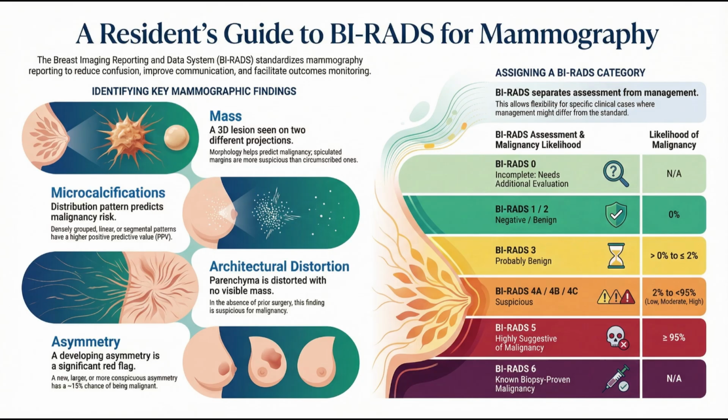So finding that dilated duct. It raises the likelihood of malignancy to over 2%, and that's the threshold. That's high enough to suggest a suspicious assessment, usually BI-RADS 4A.